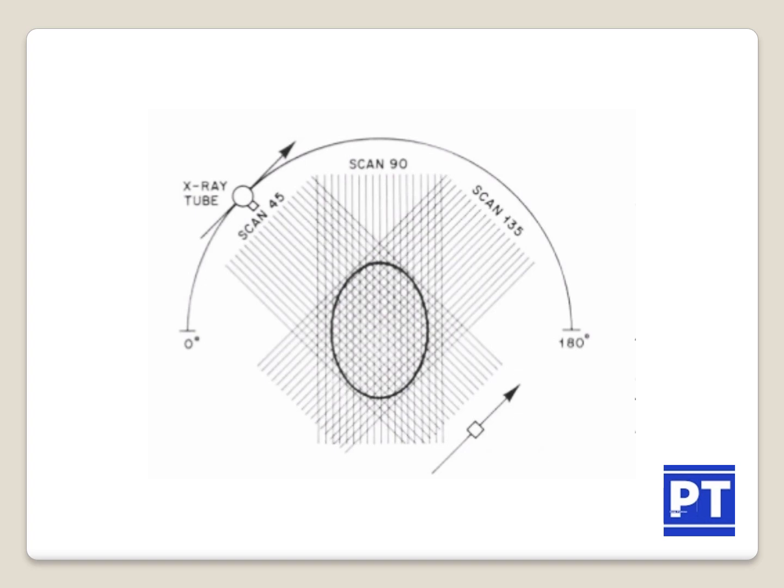Now you can see a figure. The figure is not clear, but you can also understand from this figure. The gantry moved through two different types of motion, one linear and the other rotatory, as I discussed: transit, rotate. The linear motion was repeated 180 times. Between each of these linear movements, the gantry rotated 1 degree.